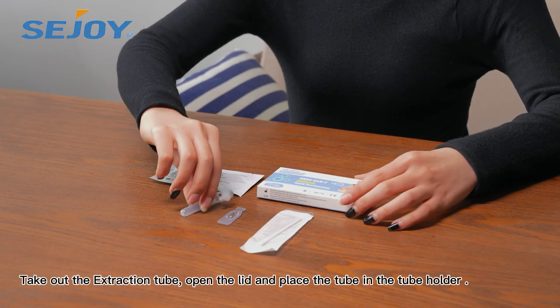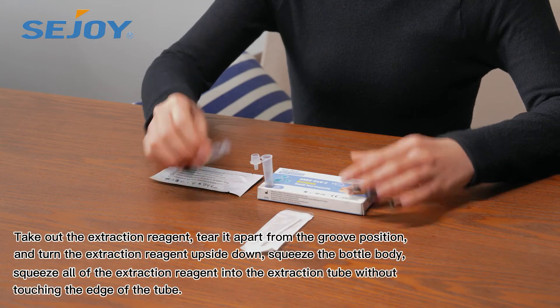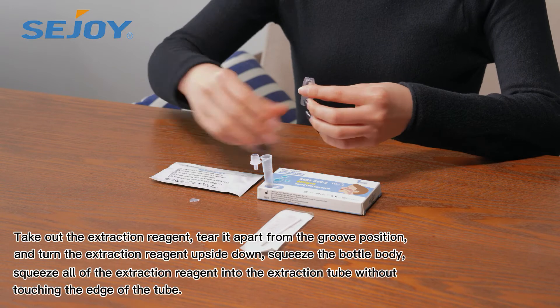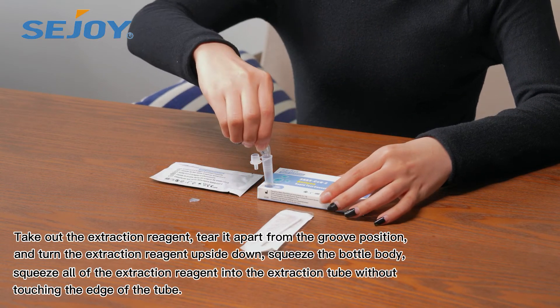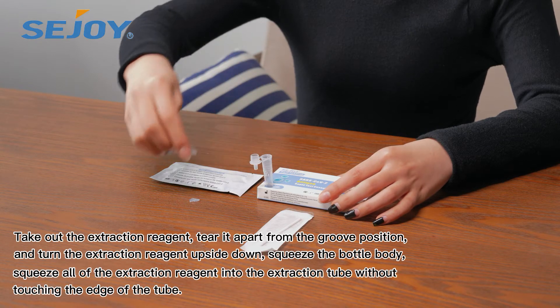Take out the extraction tube, open the lid, and place the tube in the tube holder. Take out the extraction reagent, tear it apart from the groove position, and turn the extraction reagent upside down. Squeeze the bottle and squeeze all of the extraction reagent into the extraction tube without touching the edge of the tube.